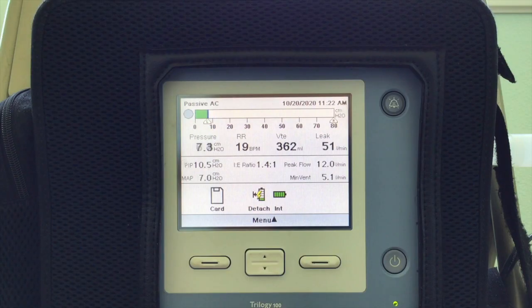One thing I also do anytime I adjust the time on my ventilator is I also check my ventilator settings. Ideally, these should not have changed. However, sometimes the settings get changed accidentally by medical staff when at an appointment or at the hospital. Whenever your medical professional sets up or adjusts the settings on your machine, always write down or take a photo of the settings which should be on your machine.